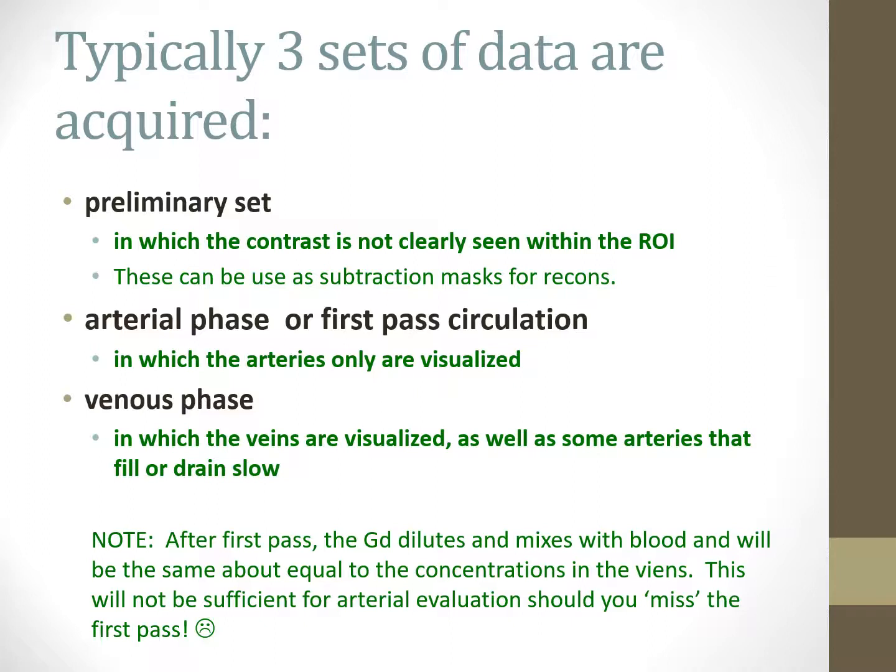Basically, after the first pass, the gadolinium is going to dilute as it mixes with the blood. So you're not going to get the same enhancement the second time through the system. So we may not be able to see enough sufficient arterial information if you missed your first pass. I'm not sure if that's ever happened to any of you. It's a sad day, and unfortunately, I can tell you that I have had this happen to me on occasion.